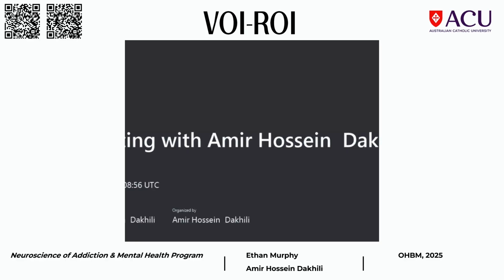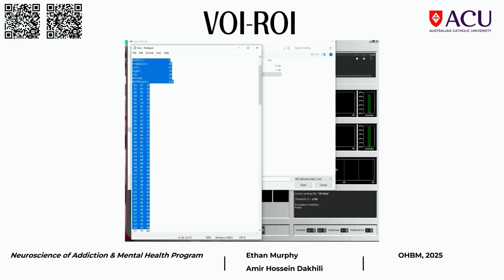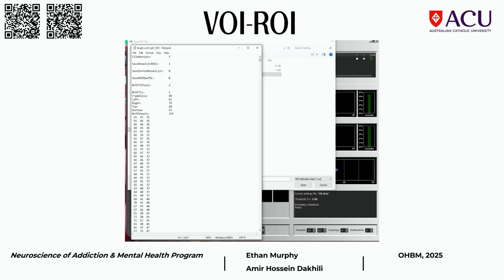This also took us weeks to find, so if you get it within a 2-hour presentation, I'll give you the whole bag of koalas. It's just a good example, though, of how you've got so far in your experiment, and something so small can actually crash TBV.